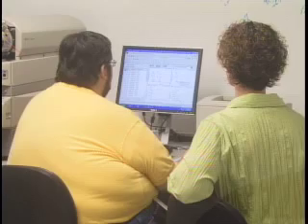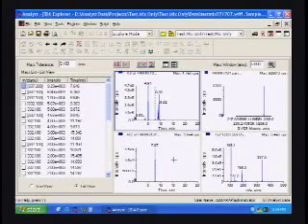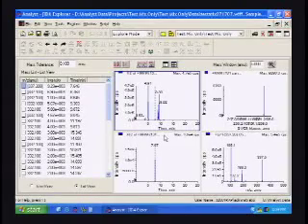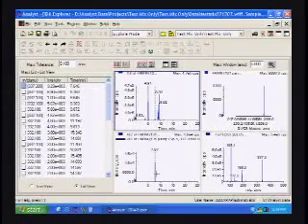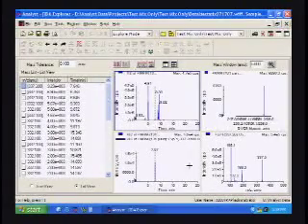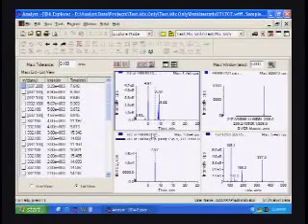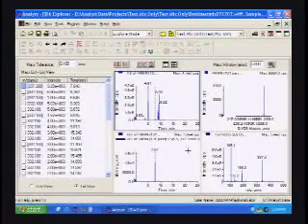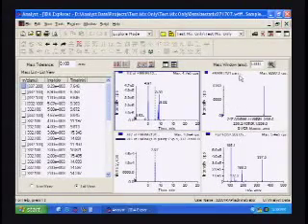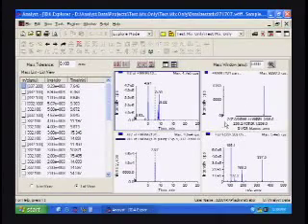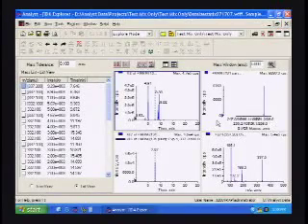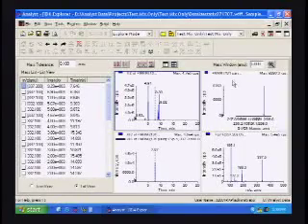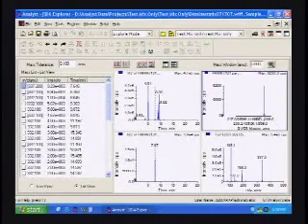Below it is a window called XIC, or extracted ion chromatogram, of a particular MRM transition. The one we're looking at here is actually the 337.2 to 188, and that is the MRM transition that corresponds directly to fentanyl. In the top right is something called positive MRM—this is an entire MRM scan. The MRMs are a list of mass parent to daughter transitions, and the instrument looks for all of them and then records this graph that you see in the top right.